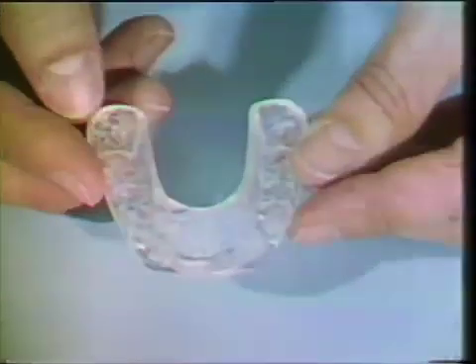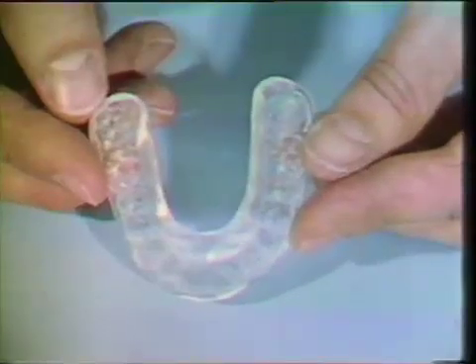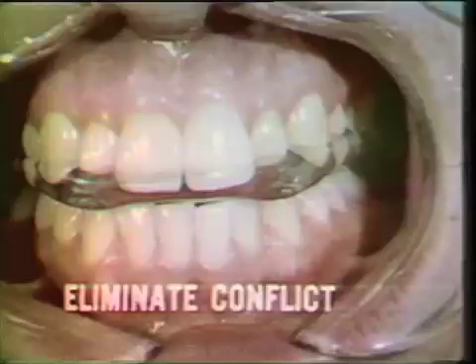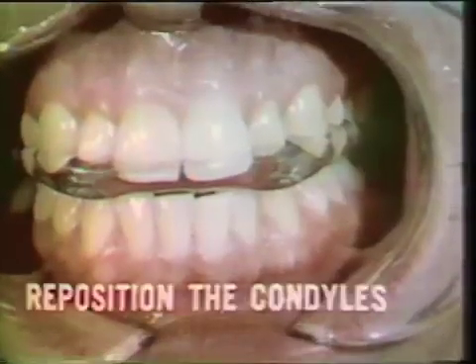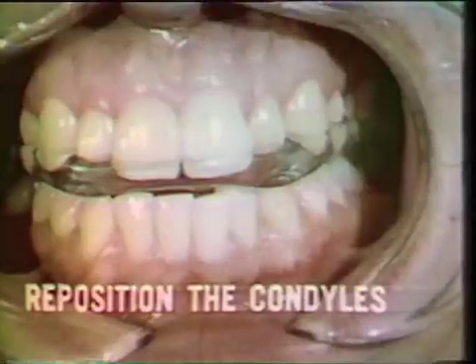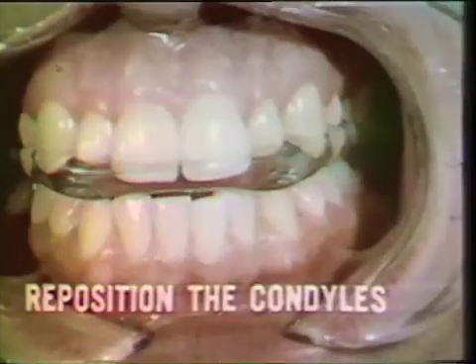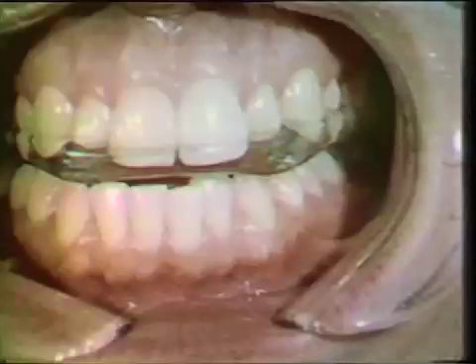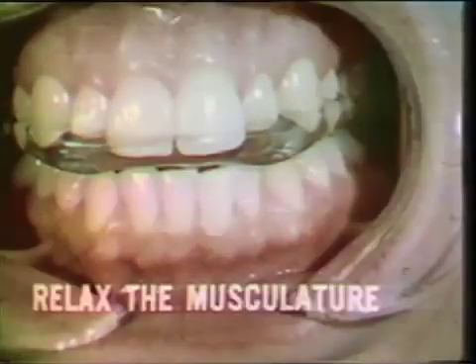Bite planes, or occlusal splints, are used to disoclude the teeth temporarily for the following purposes: eliminate conflict between occlusal and temporomandibular joint guidance; reposition the condyles to their normal position prior to registration of jaw relations; eliminate pain from temporomandibular joint and muscle dysfunction syndromes; eliminate bruxism.